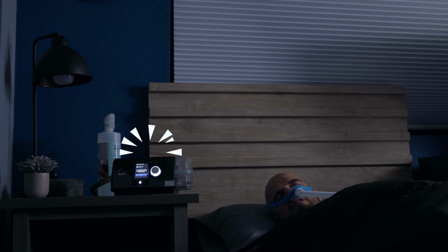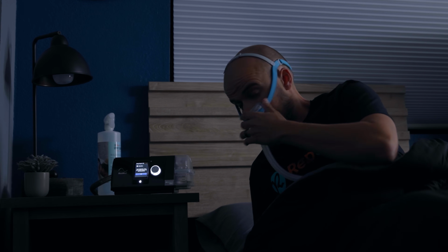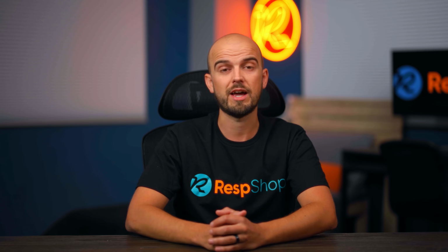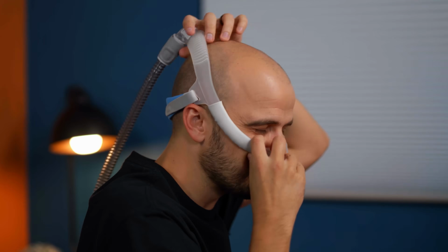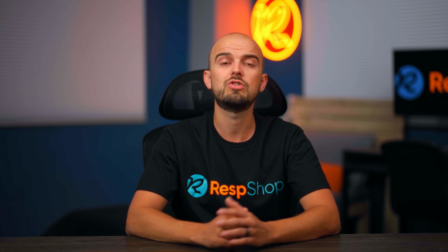Now, if you're having consistent problems with mask seal, you might have the wrong mask size. Headgear and cushions come in different sizes based on your head and nose shape and size. Get these properly measured if you have concerns. You could also try changing the kind of mask that you use, for example, by going from a nasal cradle mask to a nasal pillow mask. Different kinds of masks have different strengths of seal, and some work better with certain nose shapes than others.